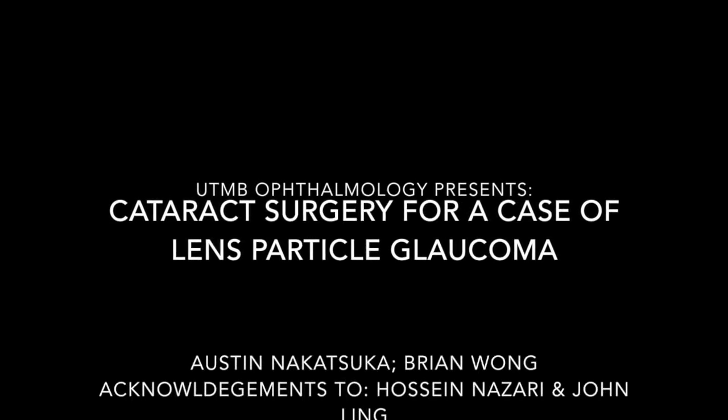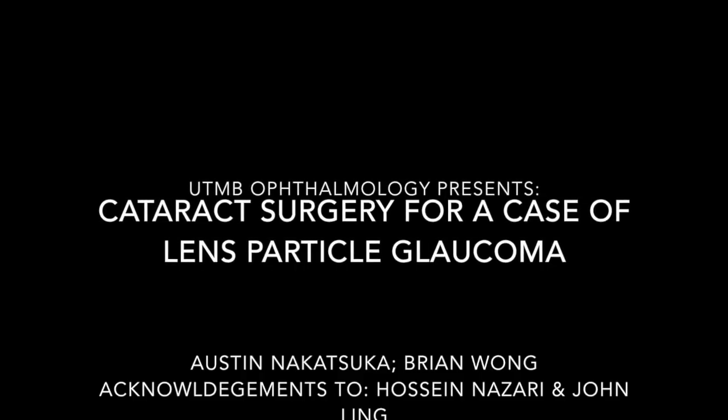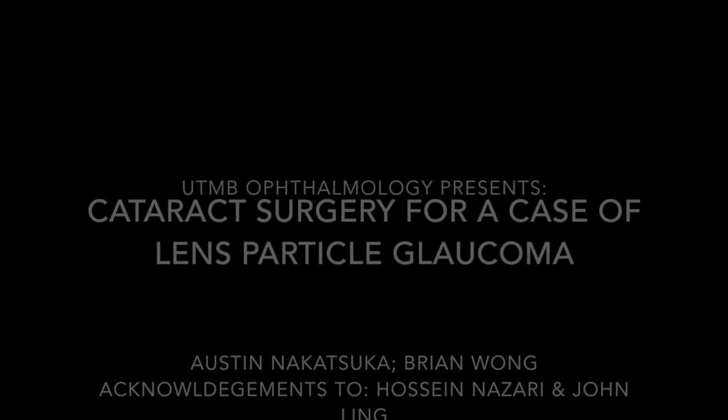Hi, this is Austin Nakatsuka at the University of Texas Medical Branch Ophthalmology Residency Program presenting a case of cataract surgery for lens particle glaucoma.